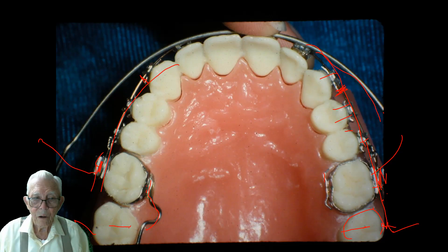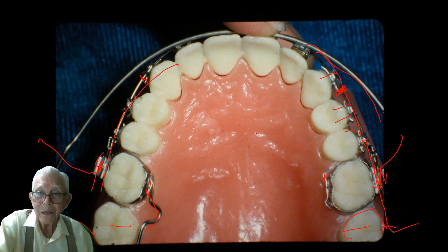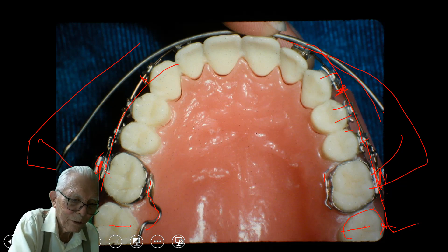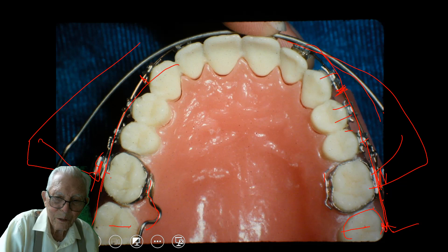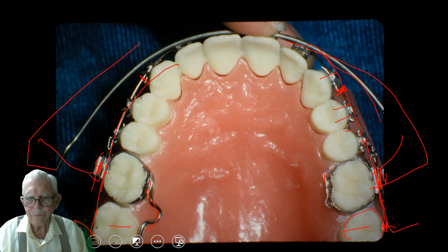Now let's get back to where we were. You have to kind of play with this the first time you've ever put one of these big arch wires in. Don't put it on some person that's not going to come back. If you had this thing expanded way out like this and you pull it in that much on each side, you've got a lot of force. Keep that tied into the bottom teeth down here too, and these teeth will just go out. We don't have to wear these very long — you can put them in for a couple of months or something like that, and you can expand the arch wires on nearly any body. Young people are especially easy — you can almost do it with your regular arch wire, but your arch wire doesn't have enough lateral force to carry that out.